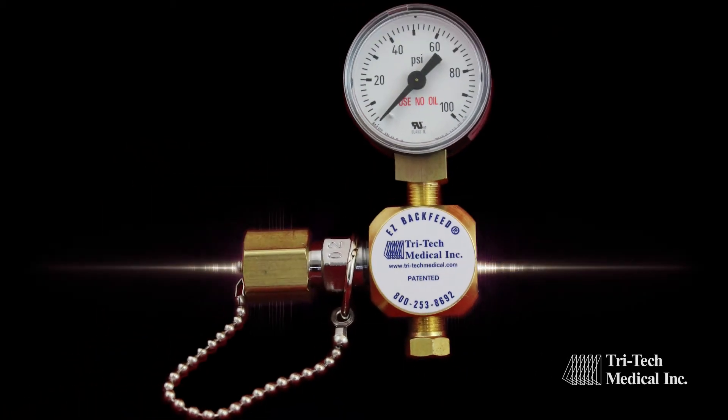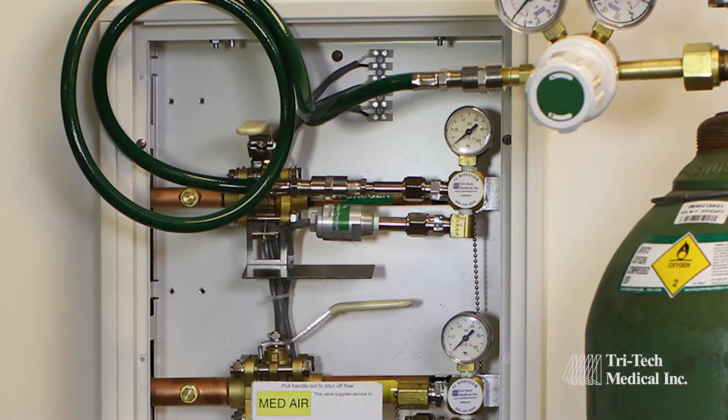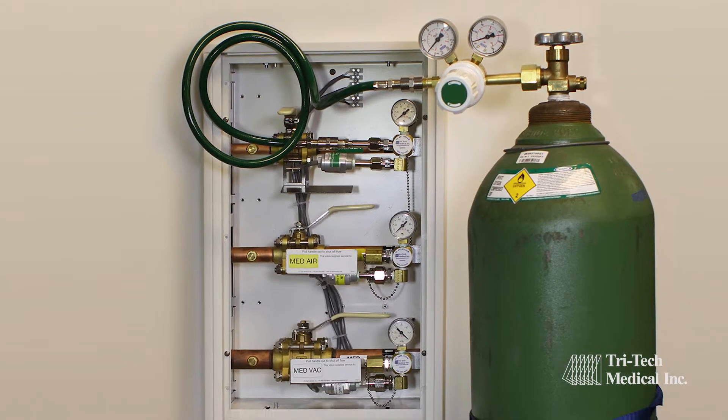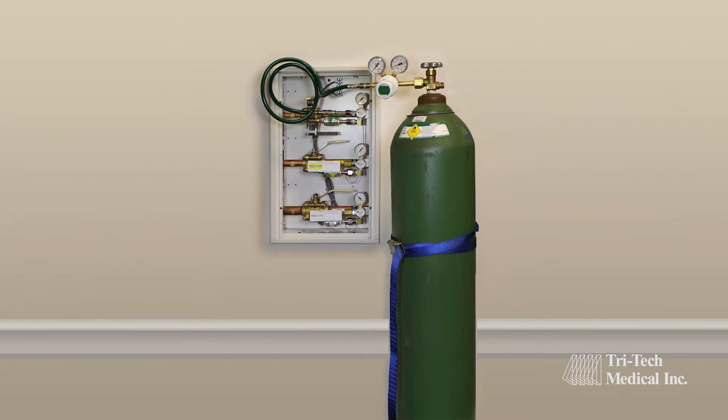Tritec Medical has a better solution through our Easy Backfeed products. The Easy Backfeed products are located in your zone valve box, providing an easily accessible place to backfeed medical gases without entering a patient room or other critical care area with high-pressure cylinders.